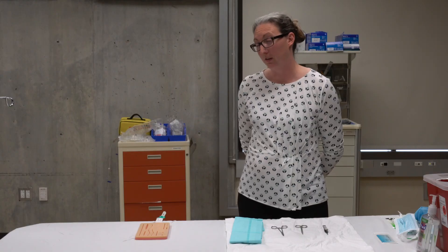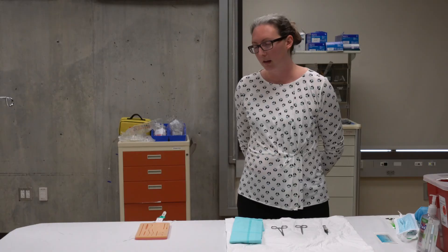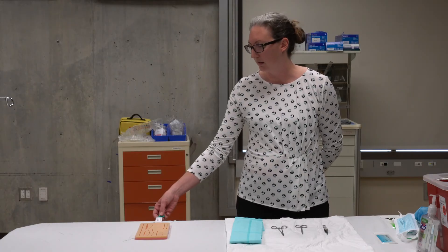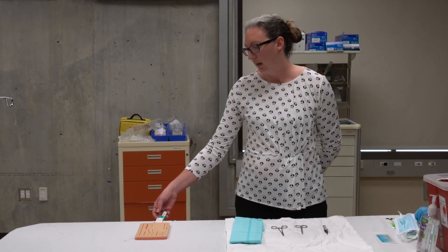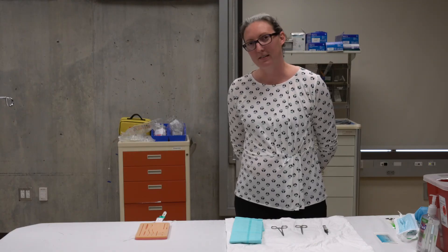The first step in this procedure is to verify the patient that you are going to do the procedure on. Usually patients in the hospital have an armband. Our patient here has an armband that says his name is James, his medical record is 123-789, and his date of birth is 12-17-1976.